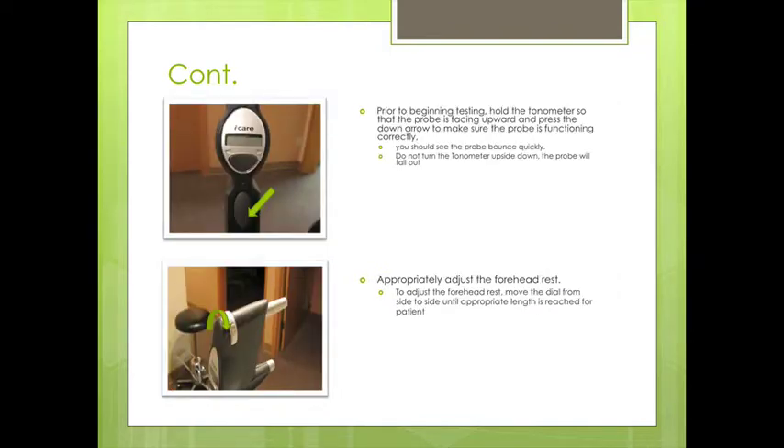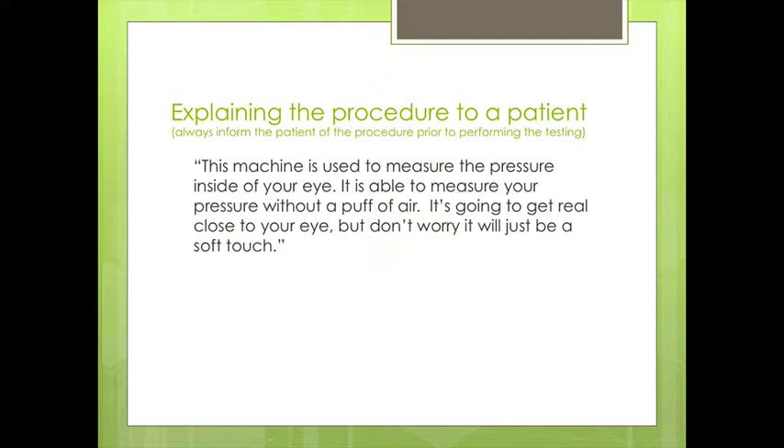Prior to beginning the testing, we want to hold the tonometer so the probe is facing upwards and press the down arrow to make sure that the probe is functioning — you should see the probe bounce quickly. Don't turn the tonometer upside down as the probe will fall out. The gray component that sticks out touches the patient's forehead, and the dial on top adjusts it back and forth to be appropriately measured for the patient.